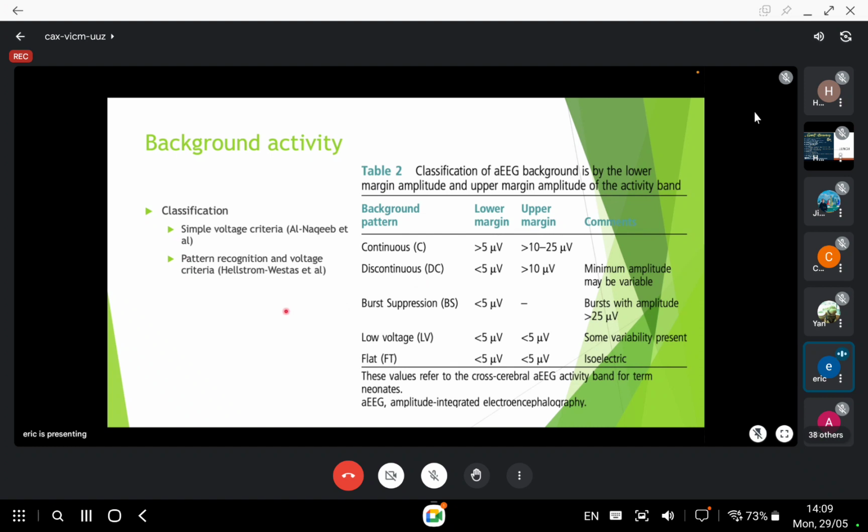So if impedance is high, then you need to work on your electrodes. So that is why I say the needles are so much easier to use, because once we place it, generally it will stay there until we take it out.